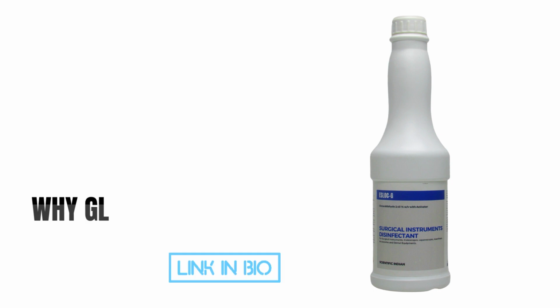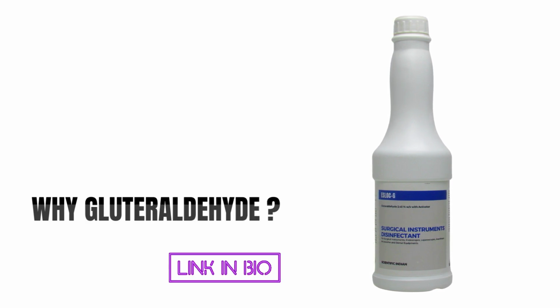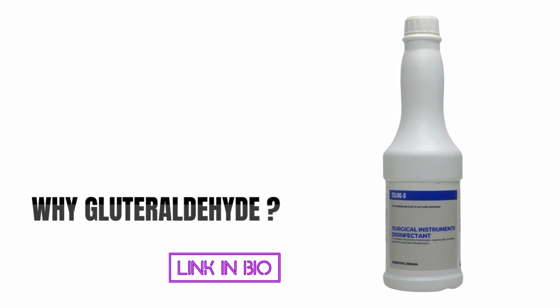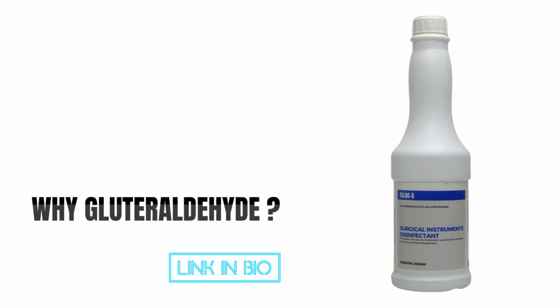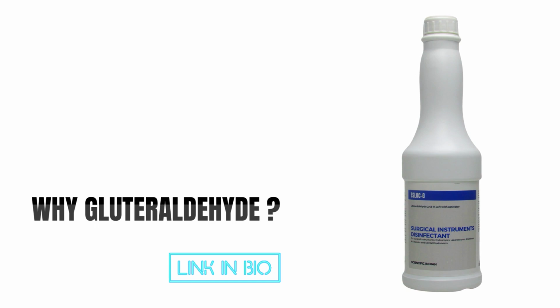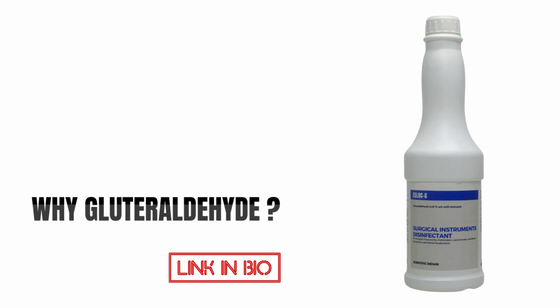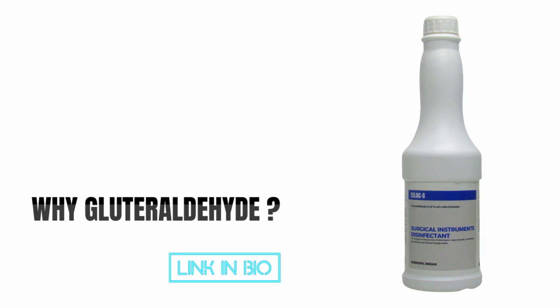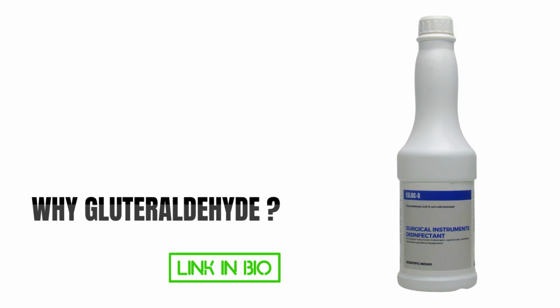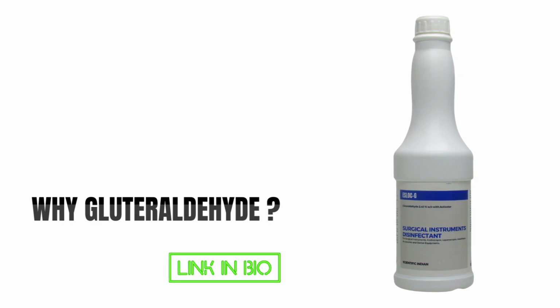It is universally accepted as an effective way for disinfection and sterilization of surgical instruments. Glutaraldehyde is a chemical that is used as a cold sterilant to disinfect and sterilize heat-sensitive medical, surgical, and dental equipment. It provides a high level of disinfection in 10 minutes. The time required for proper sterilization is around 10 hours. So you have to leave the instrument in the glutaraldehyde solution overnight.